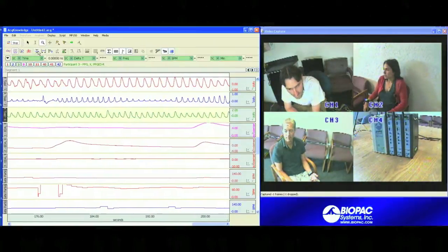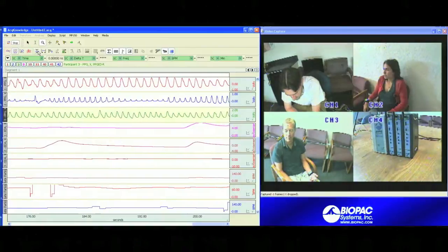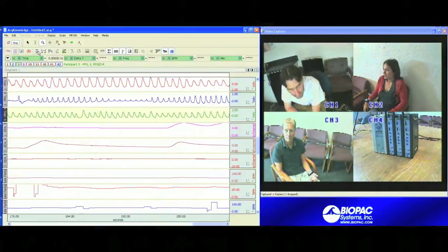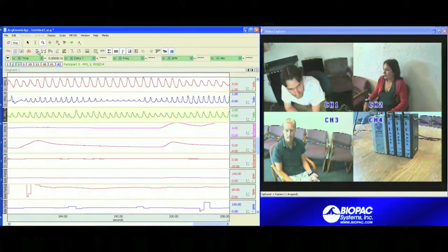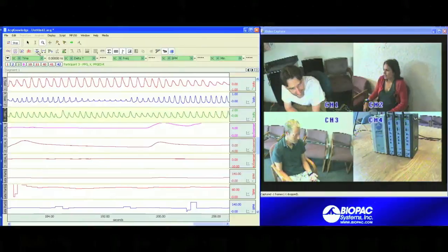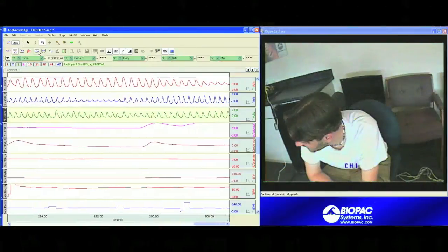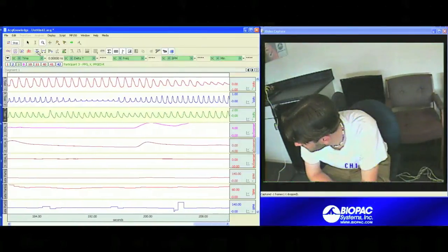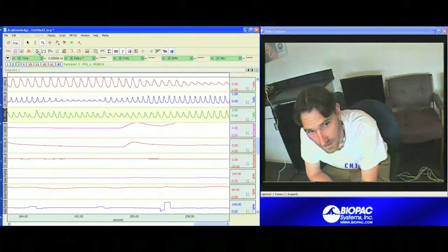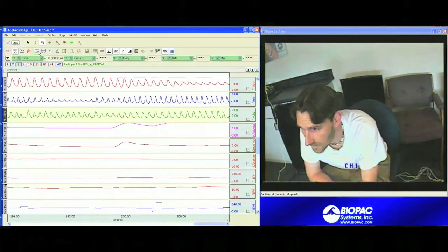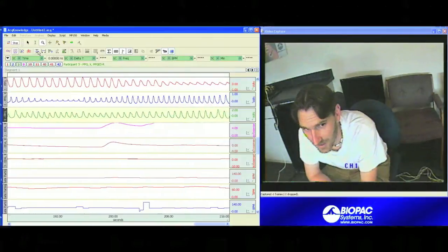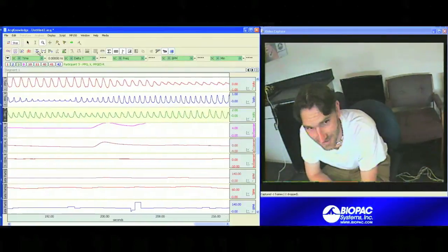The 4 camera views from the system can be stacked or you can cycle through the cameras one by one, such as we're doing here, to get a close up view of what's going on with each participant at any given time.